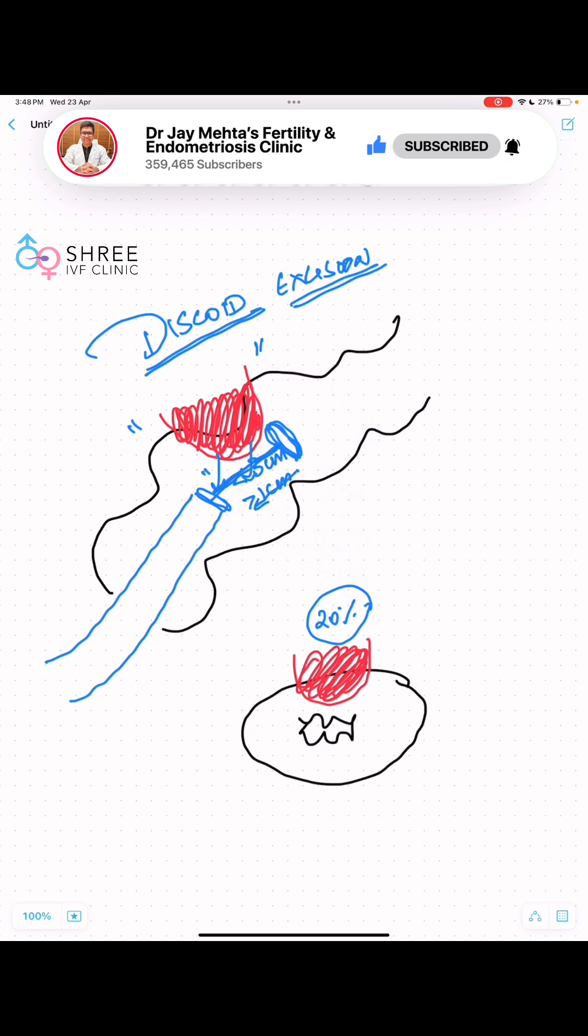When the gun closes and the staple is fired, the nodule comes out in the form of a disc outside, and as a result of this it is called a discoid excision.